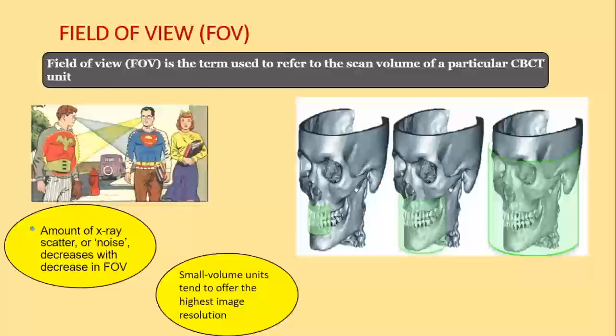It's also a legal requirement. Even if the dentist wants to see an upper six, if he asks for a large FOV, you need to talk about the six plus every single thing you see on the large FOV. You cannot miss out a single thing. So that becomes a tedious process for the diagnostic centers, wasting a lot of manpower and time.